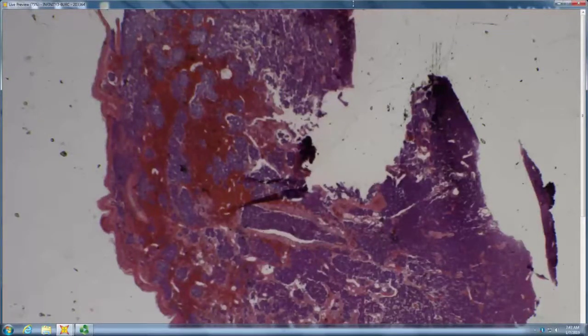Oh, pass. Okay. Pollyann, I see the Merkel cell. Merkel, very good. Why is it a Merkel? It's blue, hyperchromatic blue, and it is trabecular. Trabecular, yes. So it looks like trabecular bone where you have these interlacing walls.